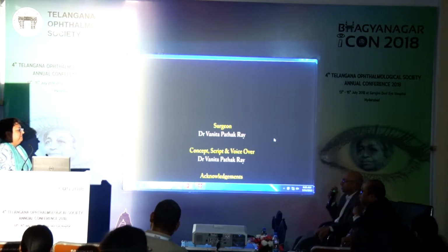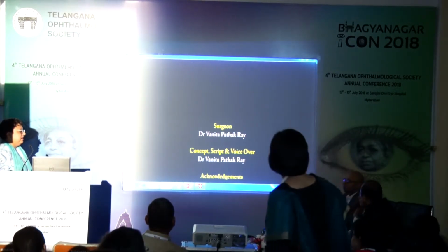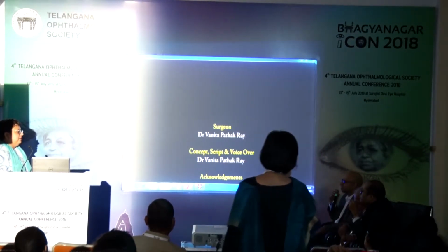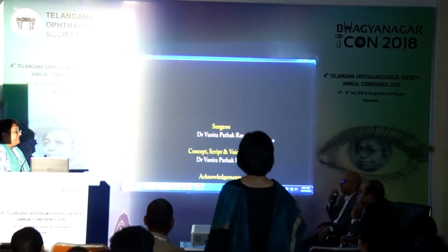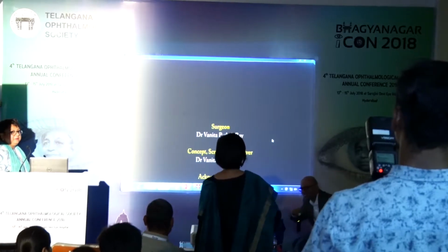Okay. Very nicely done. And I think a lot of anterior segment surgeons who often encounter this problem can do this themselves. Yeah, it's not difficult at all. They don't have to send the patient to a retina specialist if they don't have one in their practice. Yeah. I think Dr. Padmaja has a comment.